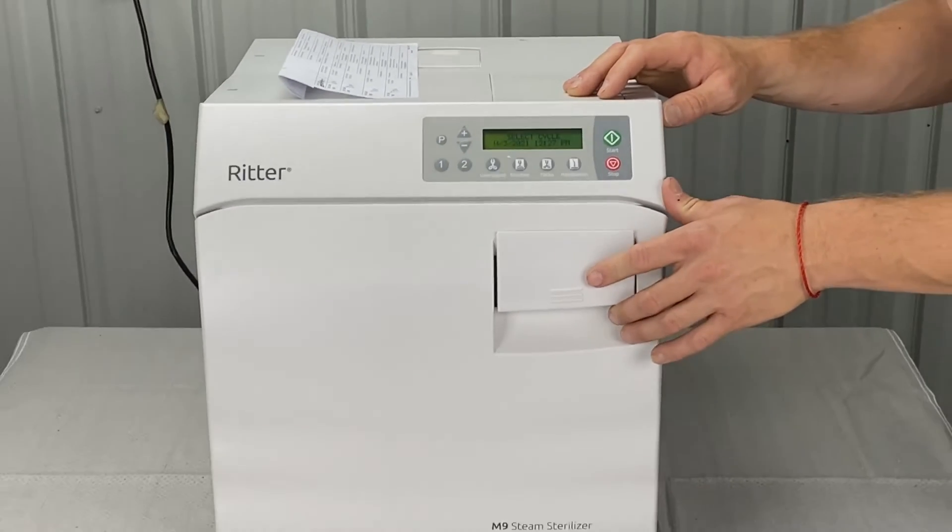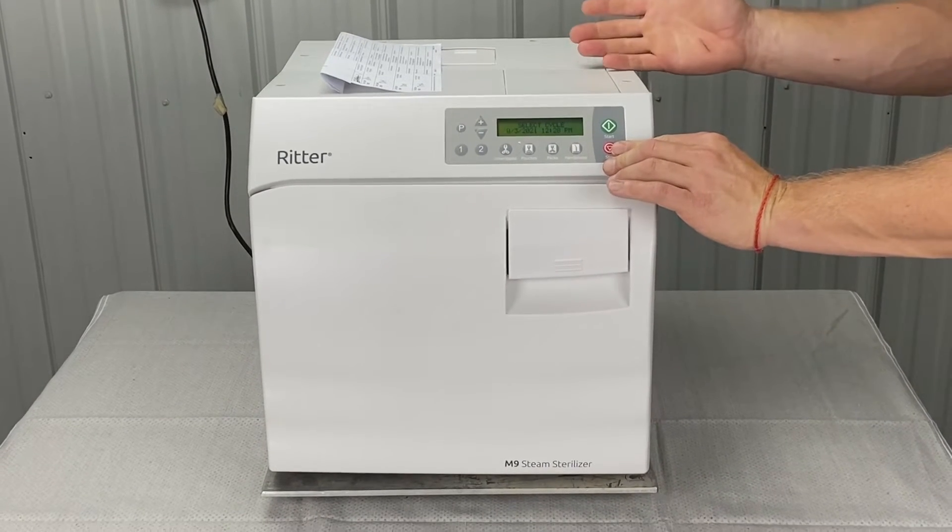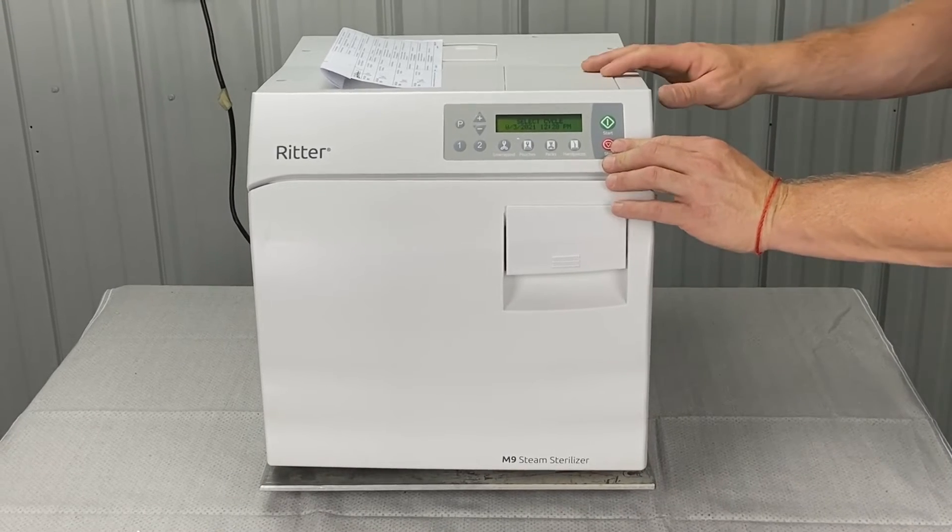There's a test you can do. We can perform key tests in service diagnostic mode. Refer to another video to go into service diagnostic mode.